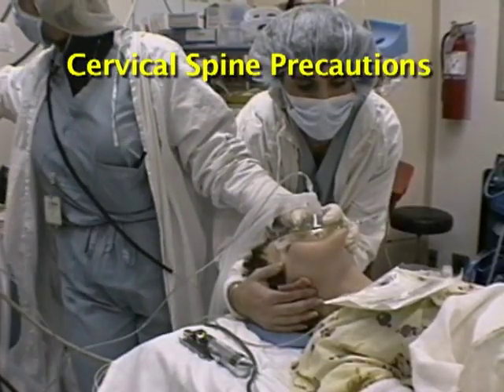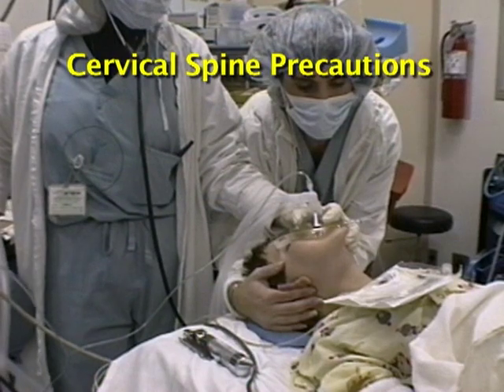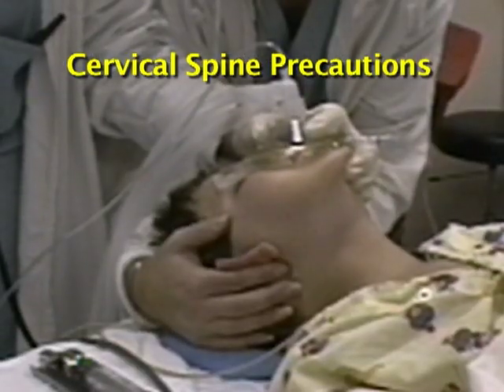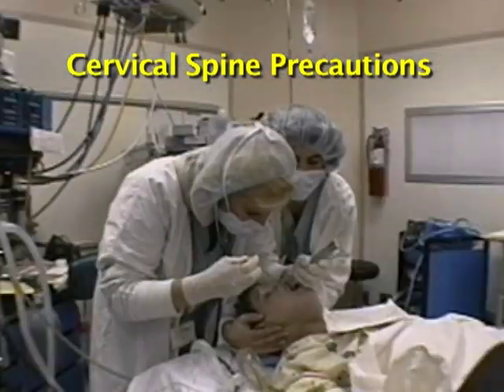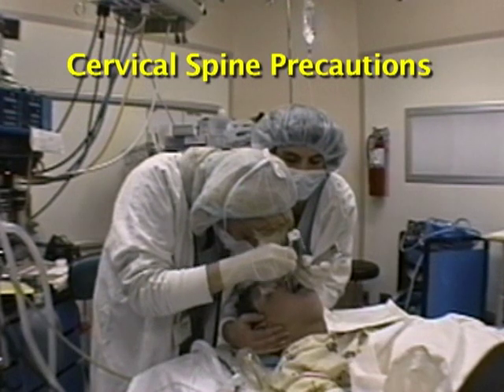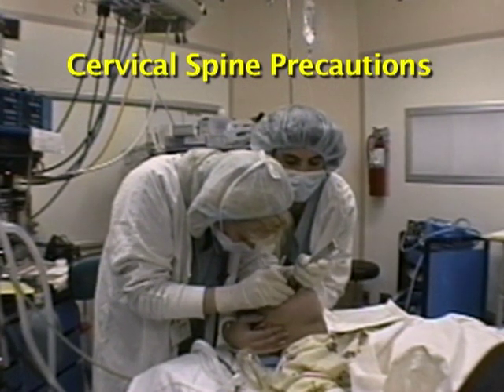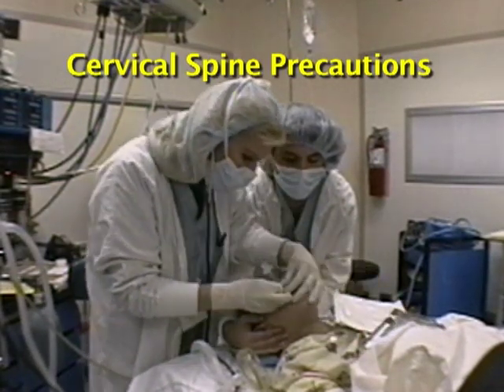Flexing the neck of a child with possible cervical spine injury can potentially cause permanent injury or paralysis. Often such patients are intubated with specialized equipment by experienced intubators. If you need to intubate such a patient in an emergency, have an assistant hold the head and neck in a neutral position while you intubate. Lift only the mandible, not the head and neck.